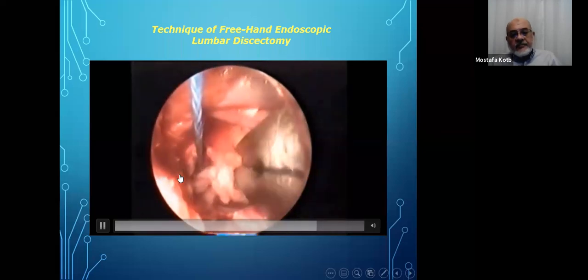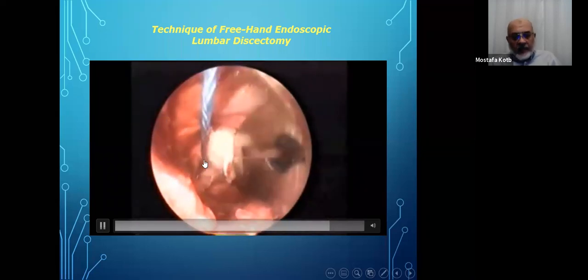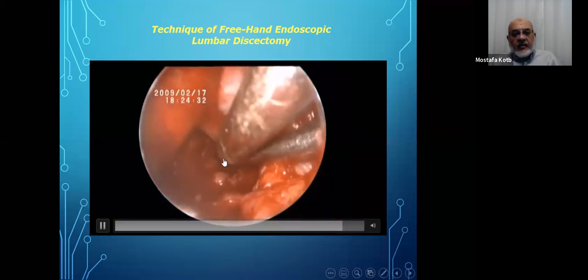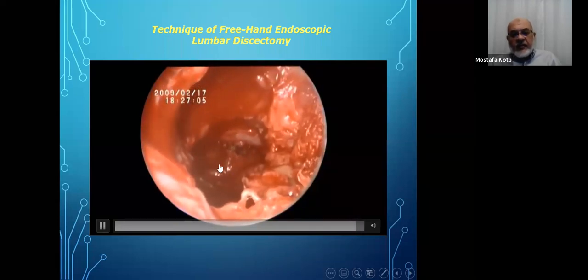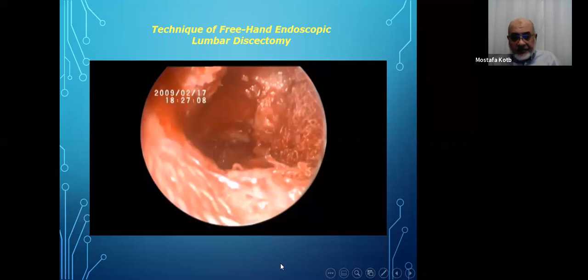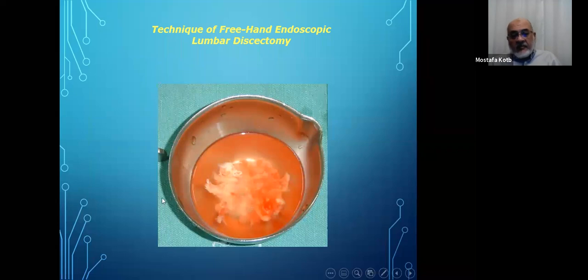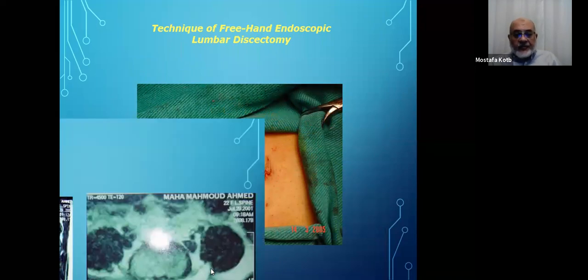Then, using the punches, the straight and the curved up and curved down punches, you start evacuating the disc totally. And at the end of the surgery, you irrigate it and make sure that the root and the theca are fully relaxed and pulsating, as you can see. This is how much disc material you can take out with this technique. And this is the wound at the end of the surgery.